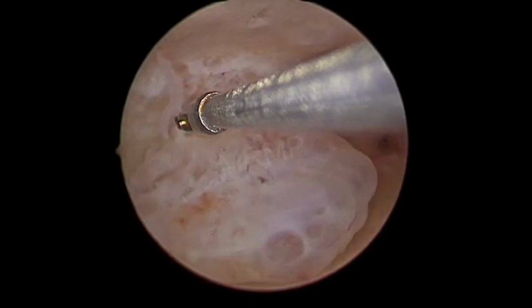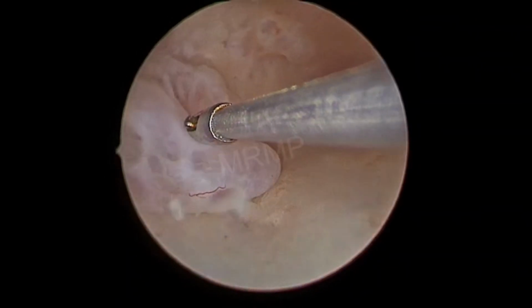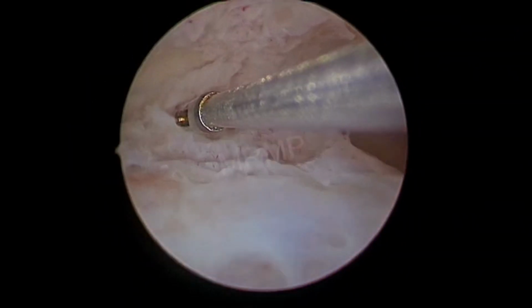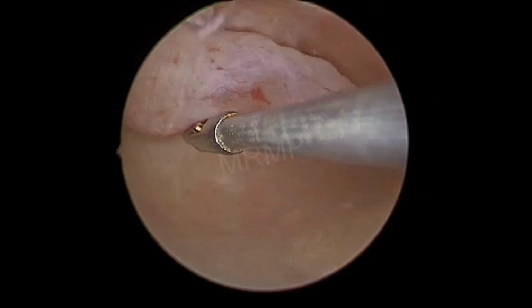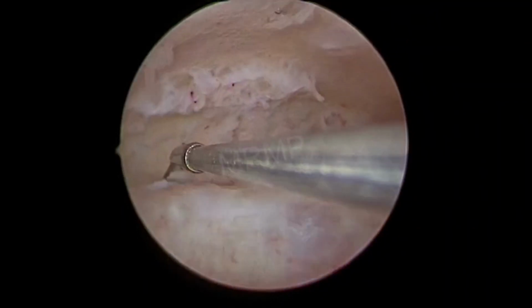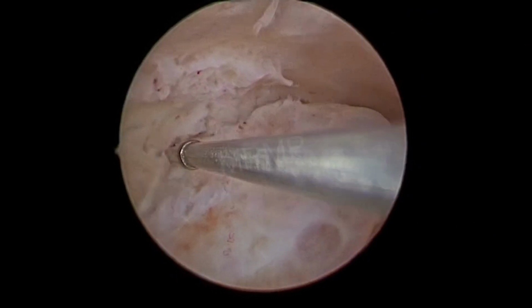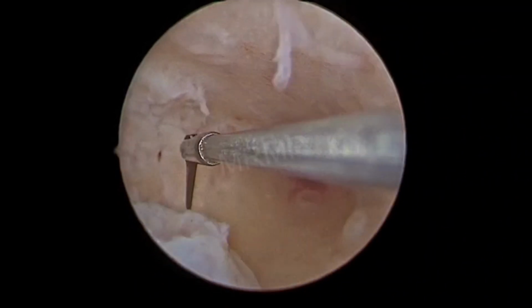In a postmenopausal lady, we must curette and the sample must be sent separately. The endometrial sample and the polyp sample should be sent separately for the histopathological study. We must be patient enough to cut the polyp stalk, and orientation and reorientation should be done so that the polyp will be detached.